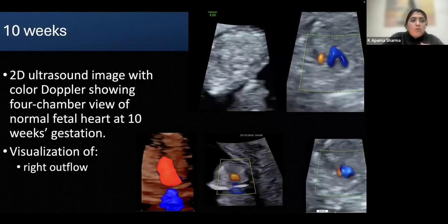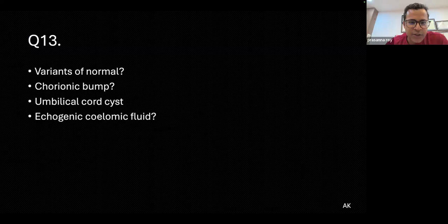So now we move on. We should be doing it only when we suspect something, right, ma'am? Not routine color or power Doppler used. Yes. So just take a 3D, and we can probably look into it later. These are some things we talk about which are less commonly done, but at least we should have the knowledge of these things.